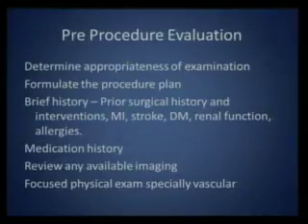What do you need by pre-procedure evaluation? This is very important. You need to know what you plan to do. You need to know why you're doing it. Is it a right indication to do that angiogram, whether it be embolization, be it stenting, be it just an angiogram? So it needs to be an appropriate exam, and you formulate a procedure plan. You have to formulate a plan in your mind how you want to approach it.